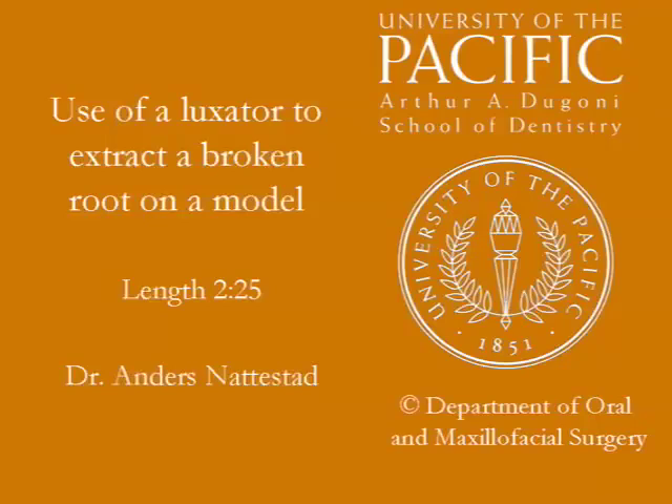This video shows how to use a luxator to extract a broken root. The video is produced and copyrighted by the Arthur A. Dugoni School of Dentistry at the University of the Pacific in San Francisco. Please note that the color on the band of the instruments may vary.